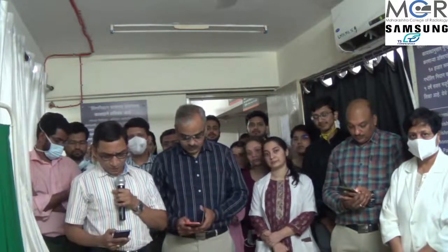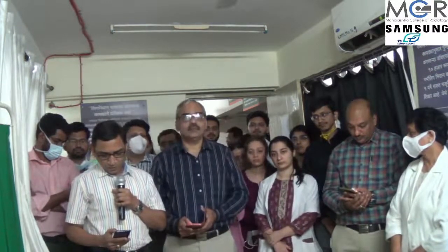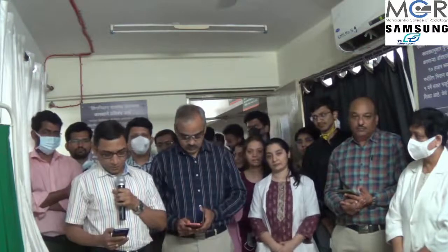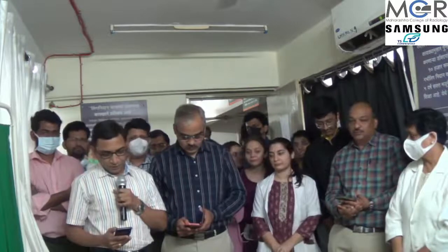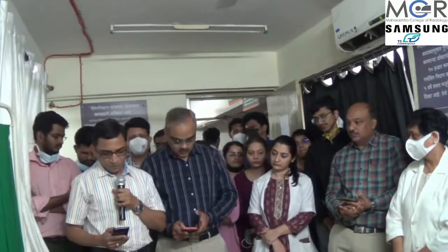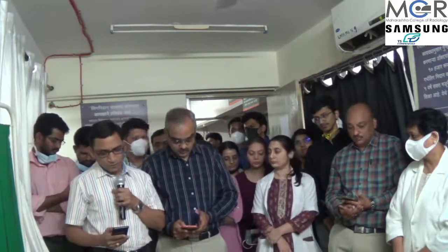Question number 3 is, if a follicle reduces marginally in size but has hemorrhage in it, has it ovulated, or is a hemorrhagic cyst anovulatory? Since the size of the follicle has reduced marginally, which suggests that it has ruptured and ovulation has occurred. Sometimes after rupture of the dominant follicle, it becomes a corpus luteum. Sometimes in the corpus luteum, you may see a hemorrhage in the form of internal echoes. So we suppose that this is a corpus luteum which has undergone a hemorrhage. So the cycle may not be anovulatory. We consider this as a hemorrhagic corpus luteum.